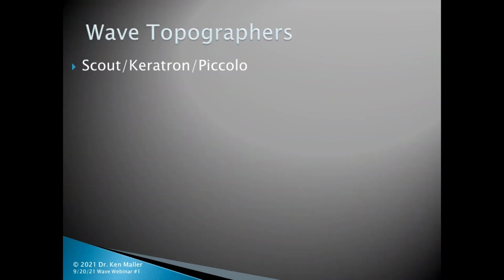All right, we start with the topographer, and the topographers that currently are compatible with WAVE are Scout, Keratron, and Piccolo. Those have been the longest running topographers that have been compatible with WAVE, and now apparently we're losing support on those, so they will eventually be phased out, but they still currently are utilized. Many of you out there have those, and I still use my Scout.